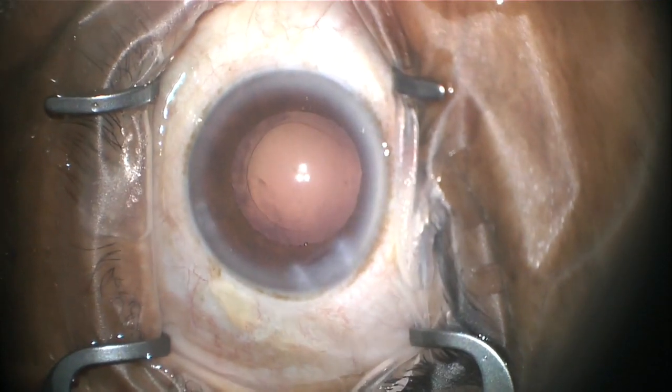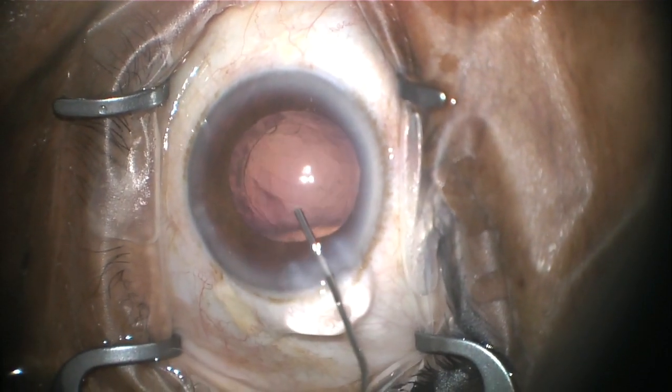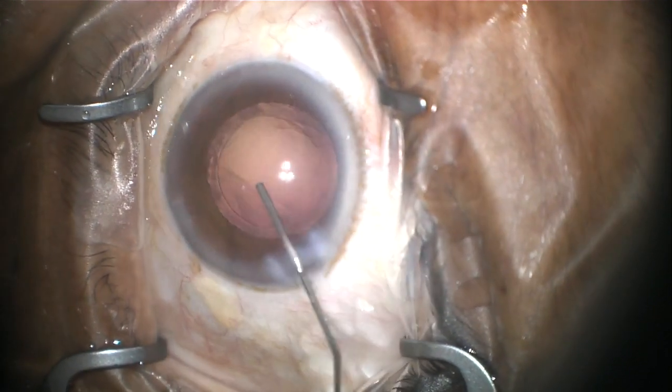At this point, the entire cataract has been removed. More of that viscoelastic gel is injected into the eye to fill up that bag that used to hold the lens.